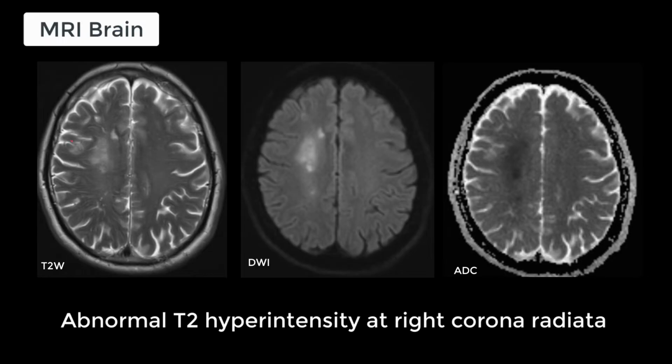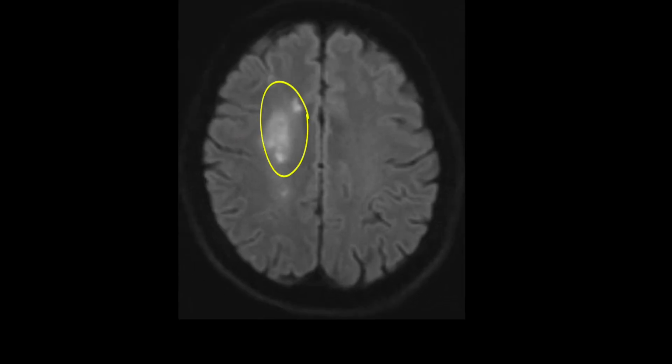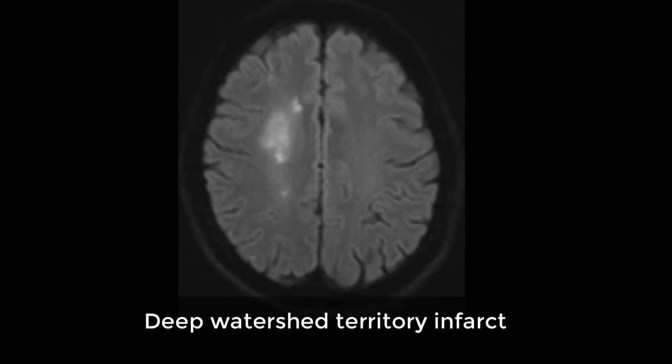MRI brain showed abnormal T2 hyperintensity at corona radiata displaying diffusion restriction suggestive of acute infarct. This location of infarct suggests deep watershed territory infarct between the perforator arteries and superficial cortical arteries.